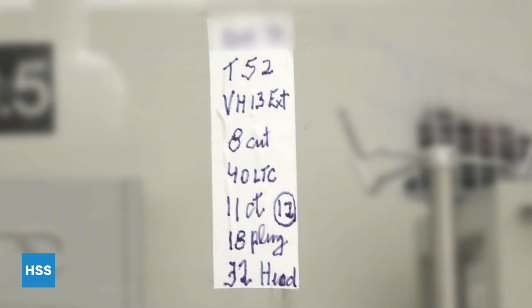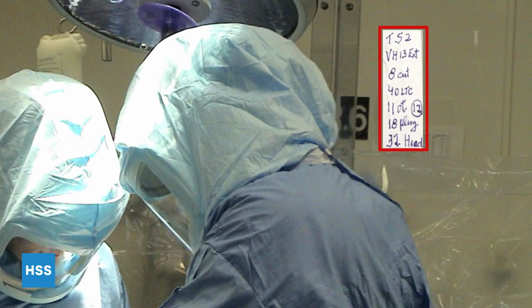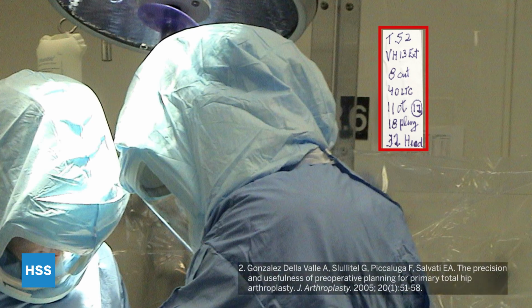distance within a circle. We select the diameter of the femoral head depending on age and cup diameter, allowing for a thicker polyethylene for the younger patient for increased longevity and a larger head in the older patient to provide more stability by increasing head-neck ratio and reduce the risk of dislocation. The adhesive tape is placed on the enclosure panel opposite to the surgeon.